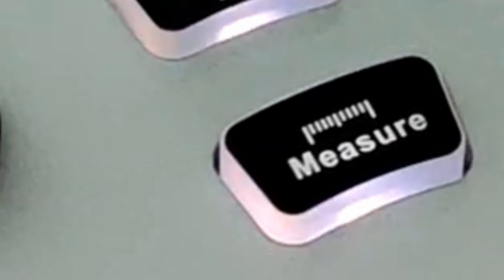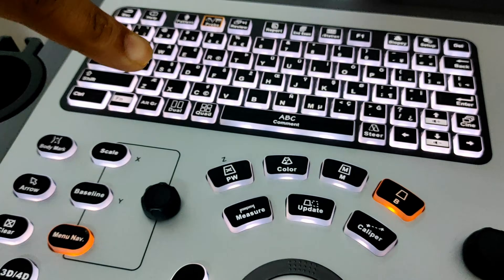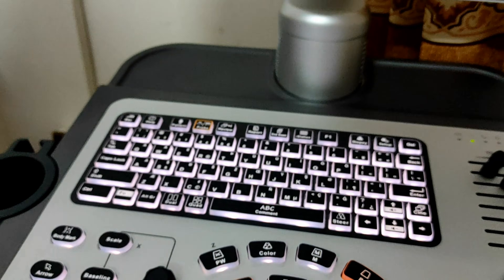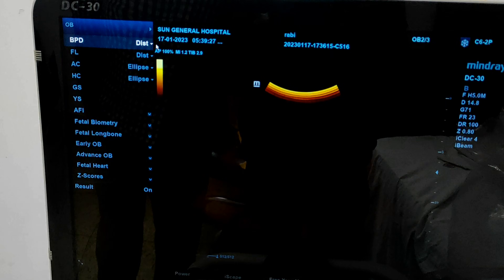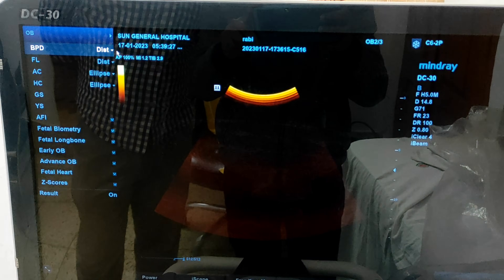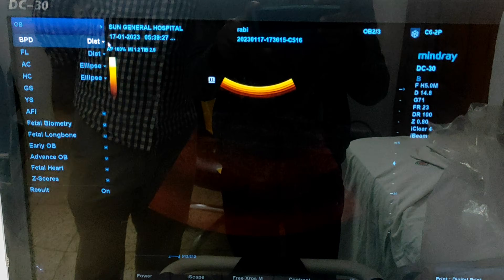For obstetrics second and third trimester, we have to measure different types of parameters. Here is our measure button. Press the measure button and different second and third trimester obstetric parameters will be shown on the left side of the screen — the first one is BPD, then FL, AC, HC, GS, AFI, and others.